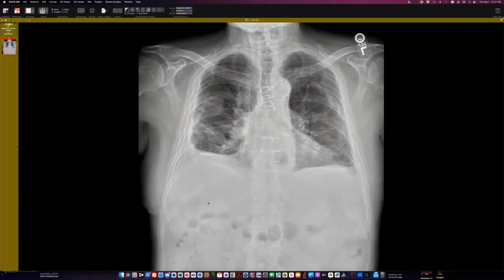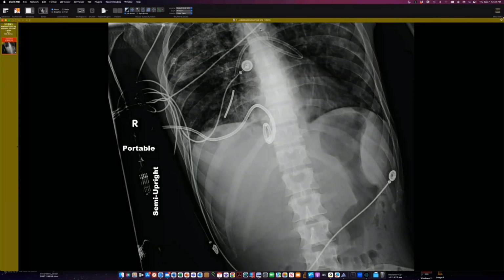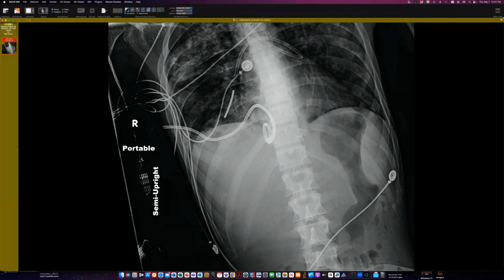Then I wanted to show you some catheter adventures here. So here's a case of an enteric tube intended for the stomach that ends up tracking into the left bronchus, crossing the carina, and ending up in a right lower lobe bronchus. So sort of a sweep of the bronchi here. So how did this occur? I believe that when the catheter went down, it initially went into the right lower lobe bronchus down here. So we see the tip of the feeding tube down here. And then they continued to push.